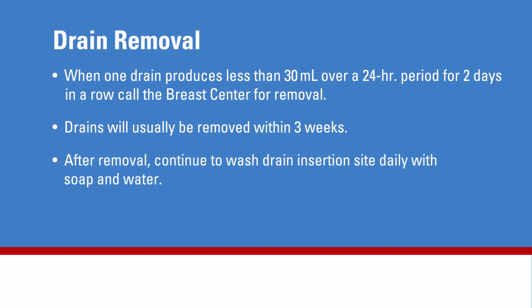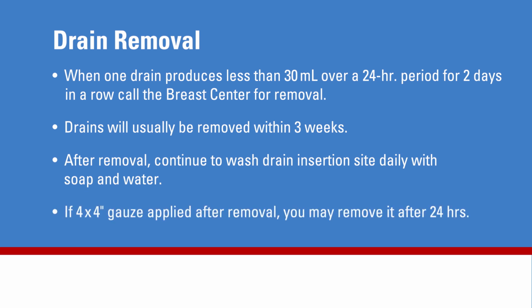After your drain is removed, continue to wash that area of your skin daily with soap and water. After the drain is removed in clinic, your nurse may tape a 4x4 gauze bandage over the drain site. You may remove the tape and gauze 24 hours after the drain is removed. It is not necessary to replace the gauze.